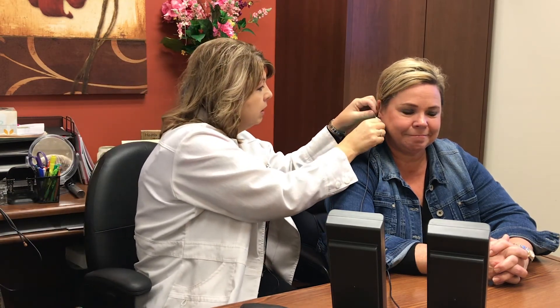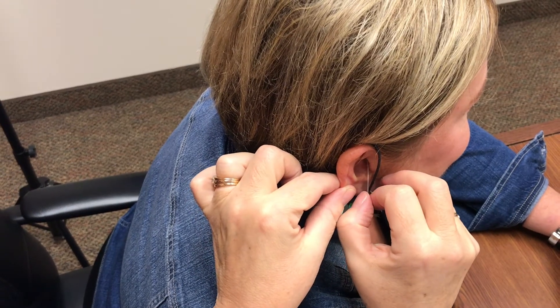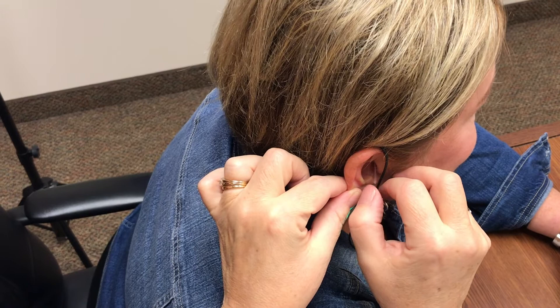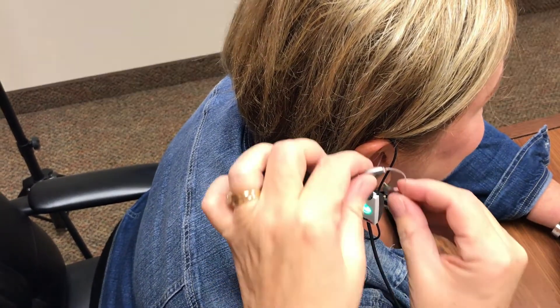Then we're going to insert a small little probe tip microphone into the ear. It's a very soft, pliable plastic tube. It tickles a little bit when we put it down into the ear canal.